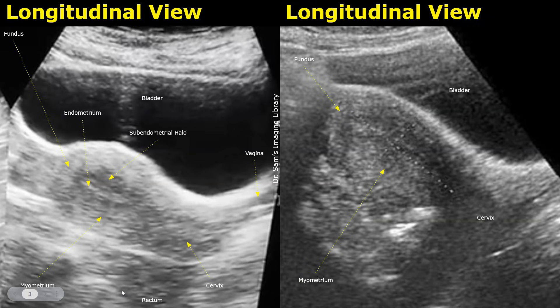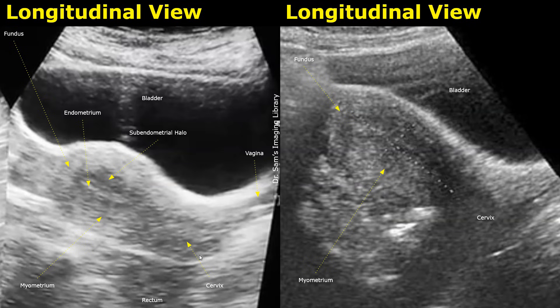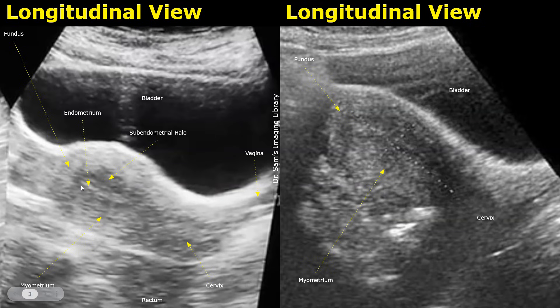These are more images of the uterus with different image qualities. In the left image, the anterior-most structures are the skin, followed by the abdominal wall. Then we have a distended anechoic bladder and the bladder wall. Posterior to the bladder is the uterus. We can see the hyperechoic outermost serosa, then the thick muscular myometrium. The junctional zone — also called the subendometrial halo — surrounds the hyperechoic endometrium. This is the cervix, and this is the vagina.